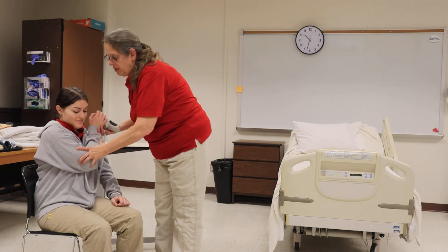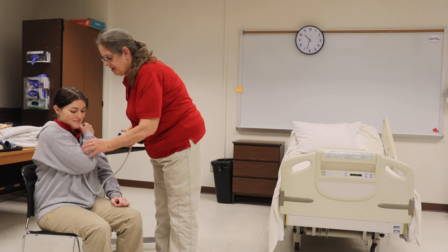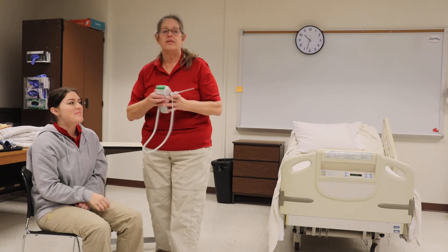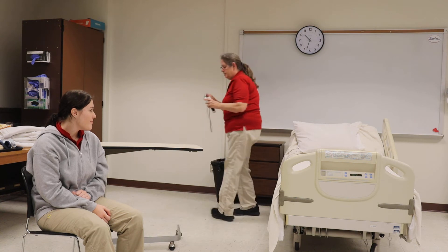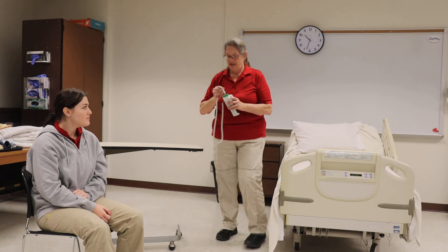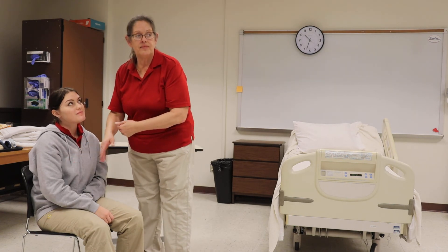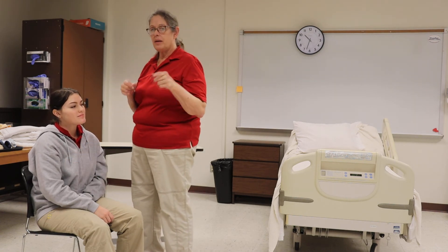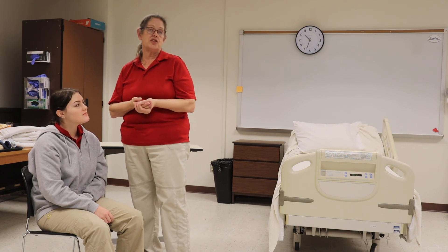And bring this arm up and hold it until it beeps. You then remove it. Note the temperature — 98.6. Replace their arm back in their clothing. And document and be sure to report any abnormalities to the charge nurse.